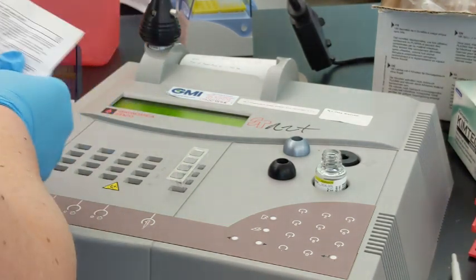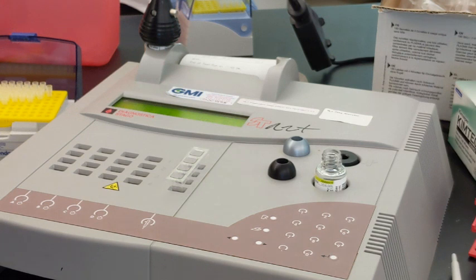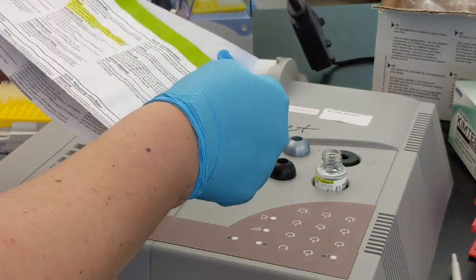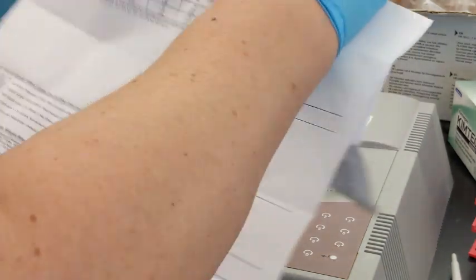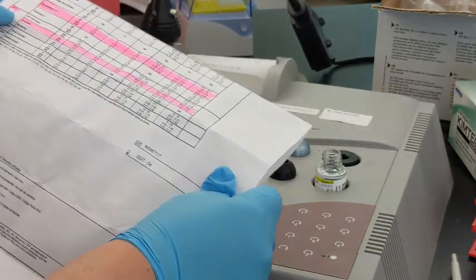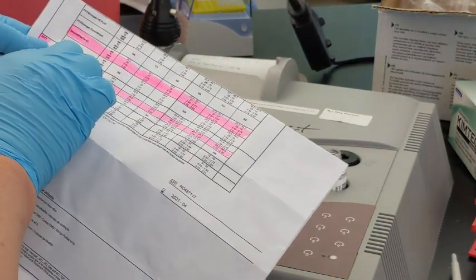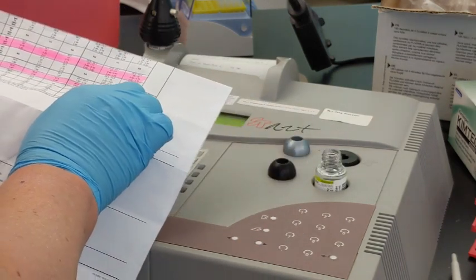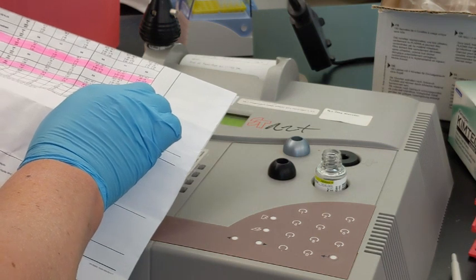And so then with the high control, again, I'm looking to make sure that I have the proper lot number, and so then looking for the test and for the reagent that I'm using, I should have been somewhere between 49.2 and 66.6 seconds.